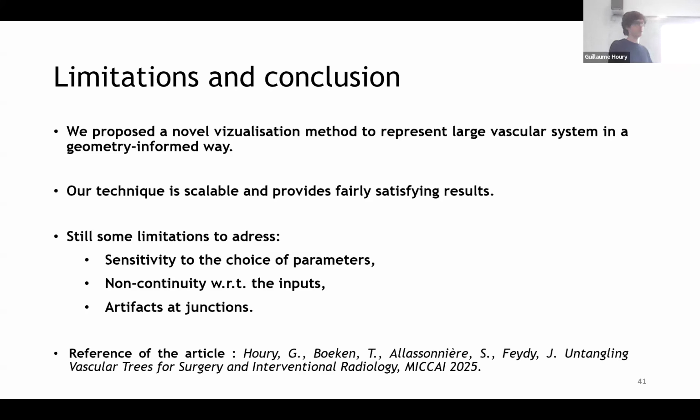We've seen that in the force-directed steps, there are many parameters to tune. It's not very obvious how to choose these parameters correctly, and from one input to the other, the right set of parameters may differ quite a lot.